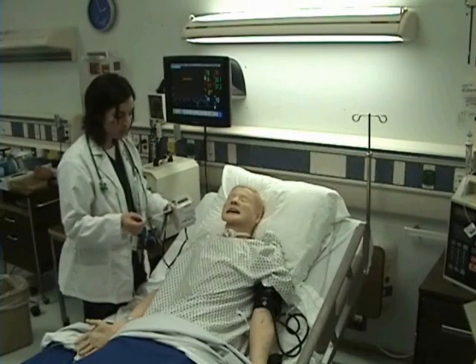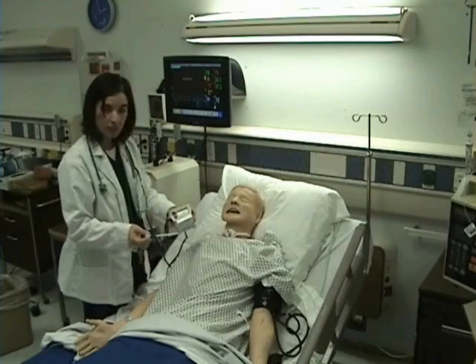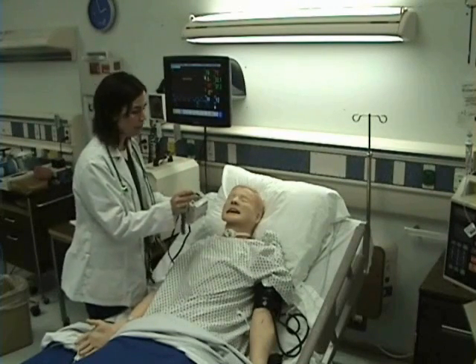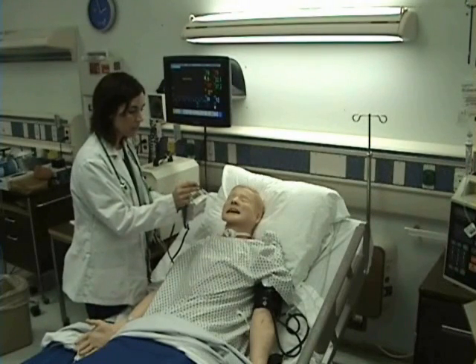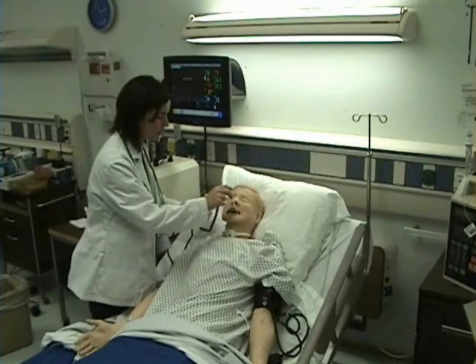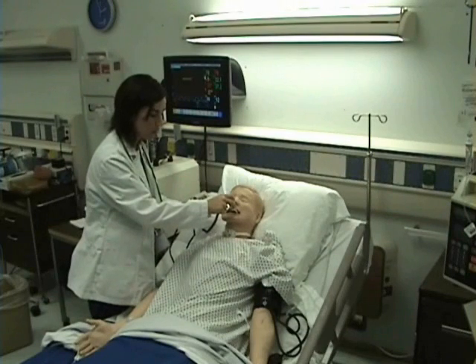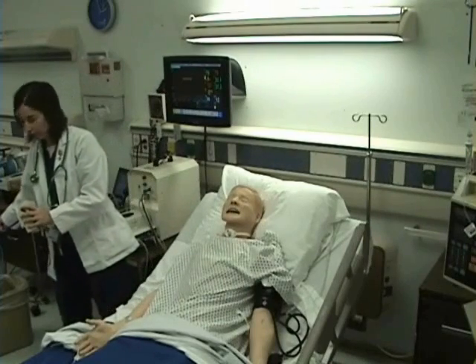I'm taking the probe of my thermometer and placing a sheath on it. Then I'm going to ask my patient to open their mouth and I'm going to place the probe under the tongue, as far back to the molars as it will go, and ask them to hold it. I will wait for my result and then dispose of the sheath.